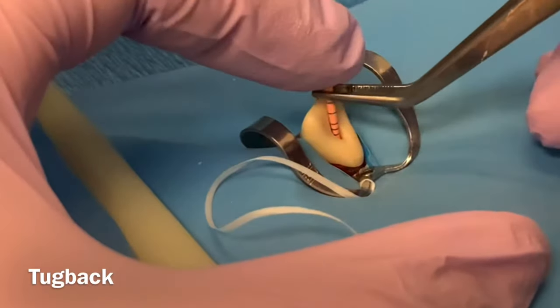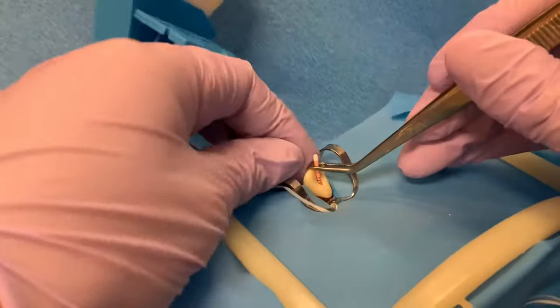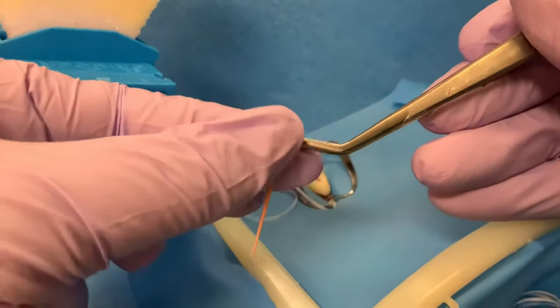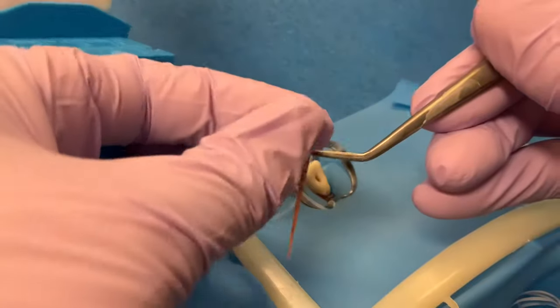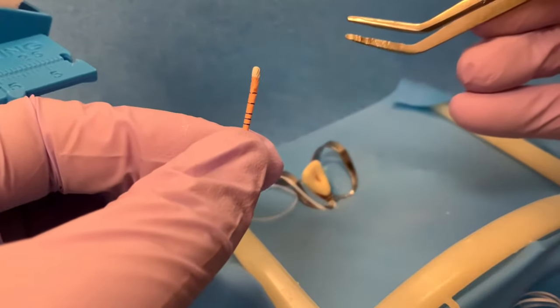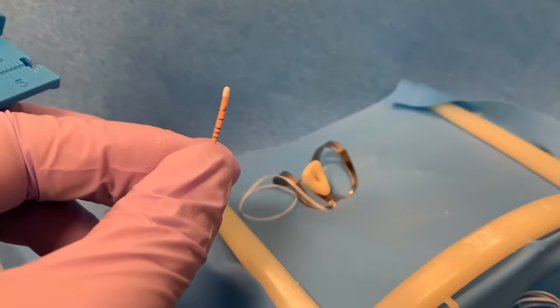After verifying that we have good tug back, grab the master cone with the college pliers at the reference point. Verify that you have the correct working length on the ruler and then squeeze the gutta percha with the college pliers until you make ridge marks. These markings will help visualize where the cone should be seated during lateral condensation.